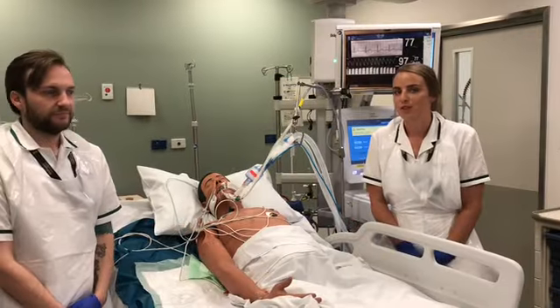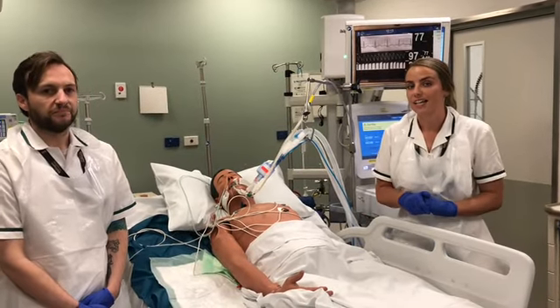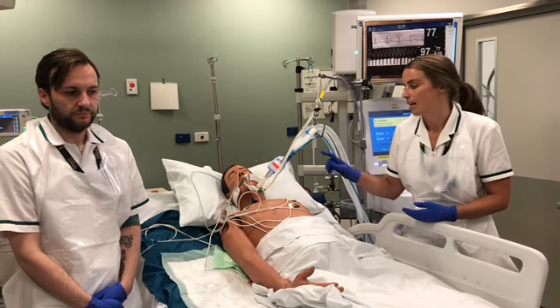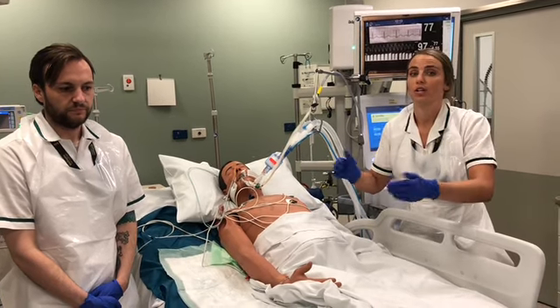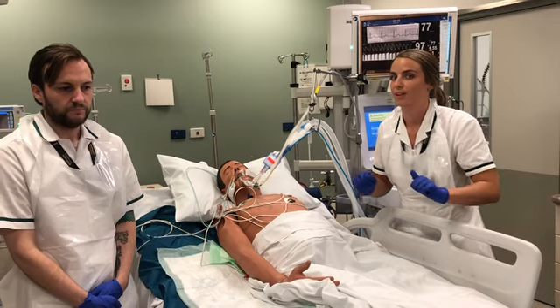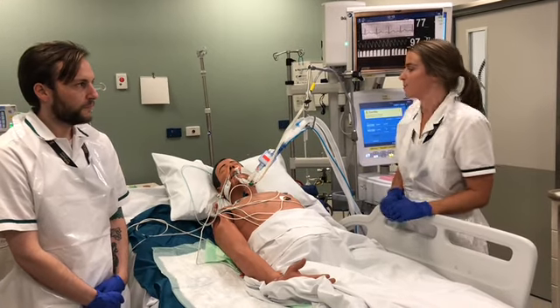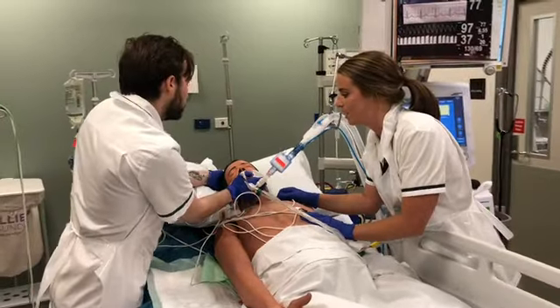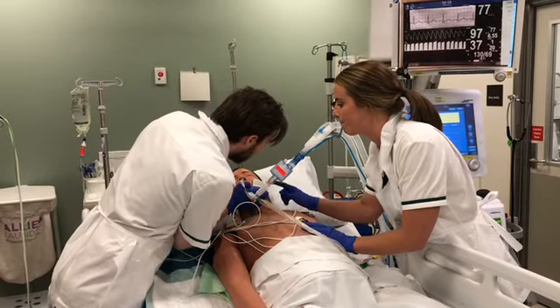Alright, moving on to section C. This is our next grouped gears. This involves changing ET tapes and doing the turn that Michael's just prepped for. So we'll get started doing tapes. Michael, are you happy to hold our tube there? I have got that tube secured and we were 20 centimetres at our teeth.